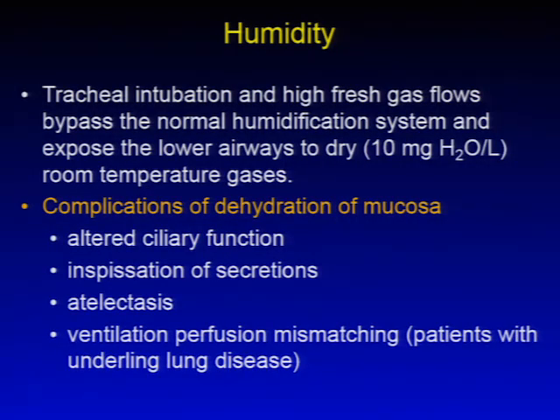Humidity. Tracheal intubation and then high gas flow during general anesthesia with the normal humidification system bypassed, and exposure of the lower airway to dry gases, causes dehydration of the mucosa. What are the complications of the dehydration of the mucosa?